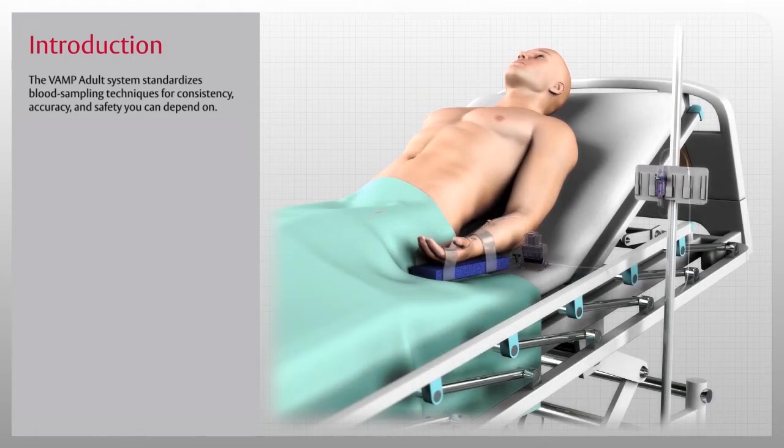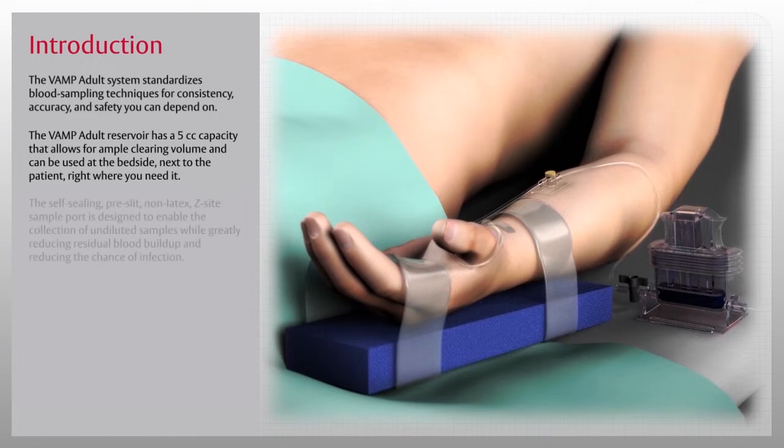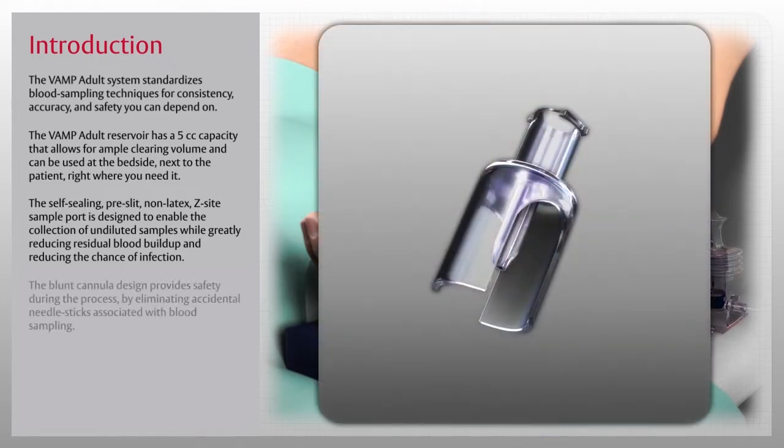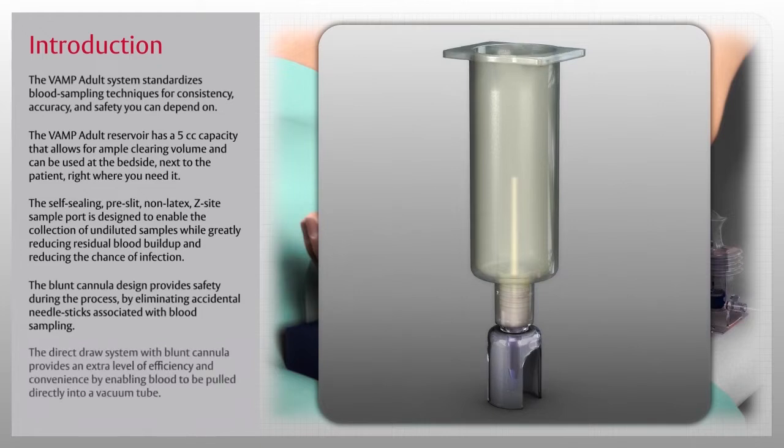Setup, priming, sampling, and flushing are quick and easy with the VAMP Adult System. The VAMP Adult reservoir has a 5cc capacity that allows for ample clearing volume and can be used at the bedside right where you need it. The self-sealing, pre-slit, non-latex Z-site sample port is designed to enable collection of undiluted samples while greatly reducing residual blood buildup and reducing the chance of infection. The blunt cannula design eliminates accidental needle sticks, and the direct draw system allows blood to be pulled directly into a vacuum tube.